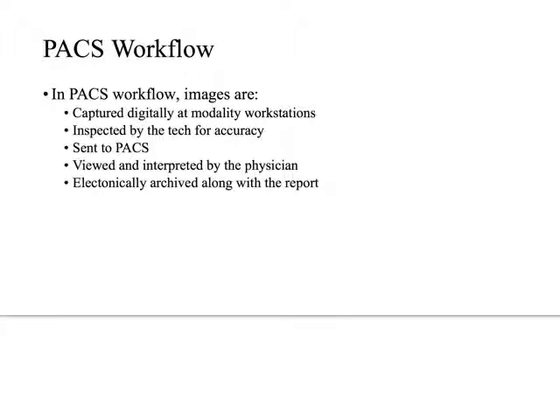So let's talk a little bit about that workflow, because that's kind of what I'm hinting at: the way that the future will be determined is largely based on our everyday workflow, like what we do in our department on a day-by-day basis. We typically start by capturing a digital image at whatever modality we're working at. We will look at the image real closely as technologists to make sure that it's accurate, is it labeled correctly, is everything there on the image that we need, is it a diagnostically optimal image. We'll send it over to PACS, and then it's going to be viewed and interpreted by a physician, and then that's electronically archived along with whatever report was generated.